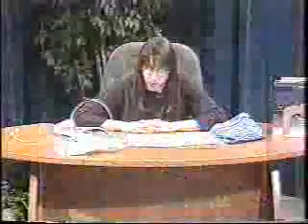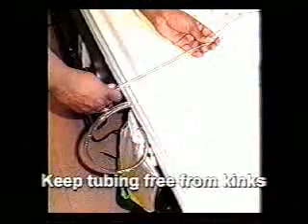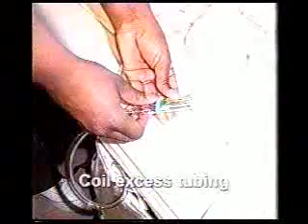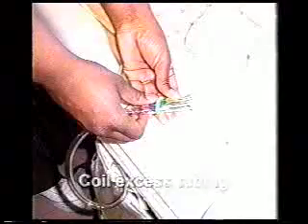Note that the catheter leg strap may not be used if the patient has a circulation problem, and also if their skin has irritation from the leg strap, it would not be used. Make sure the tubing is free from kinks and that the urine is flowing freely by coiling excess tubing and attaching the tubing to the bed linen with a plastic clip.